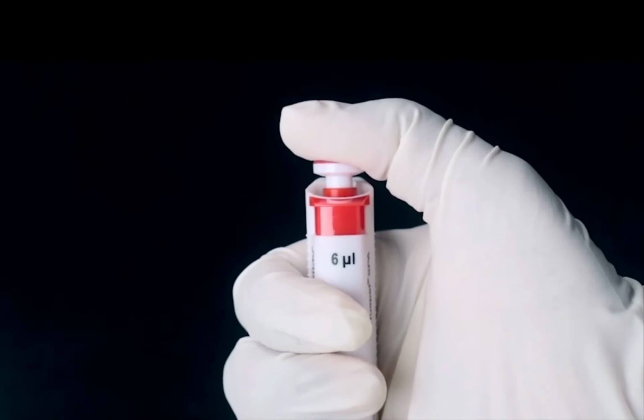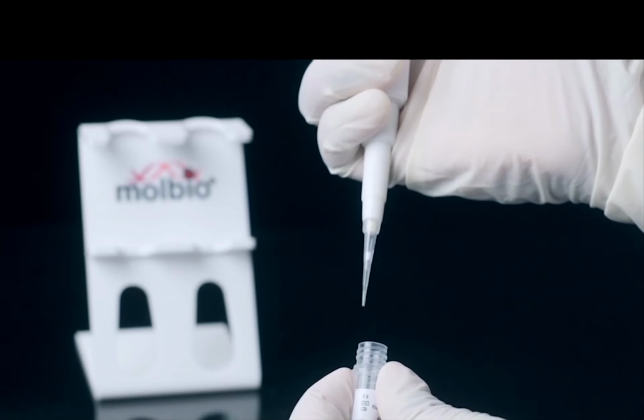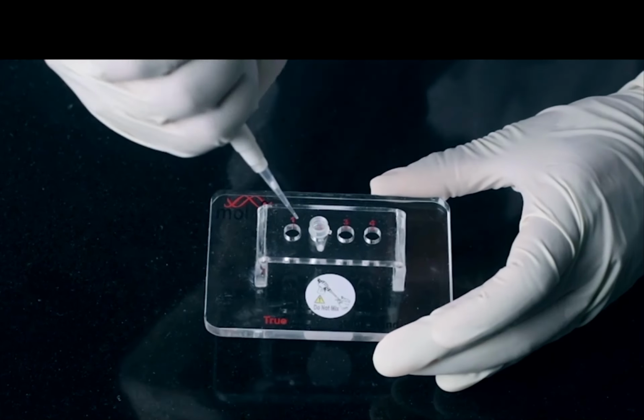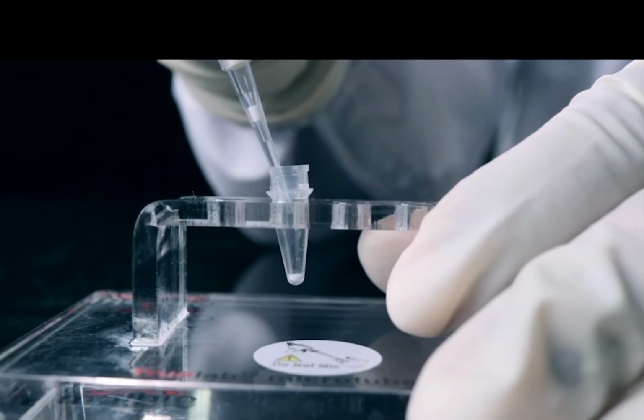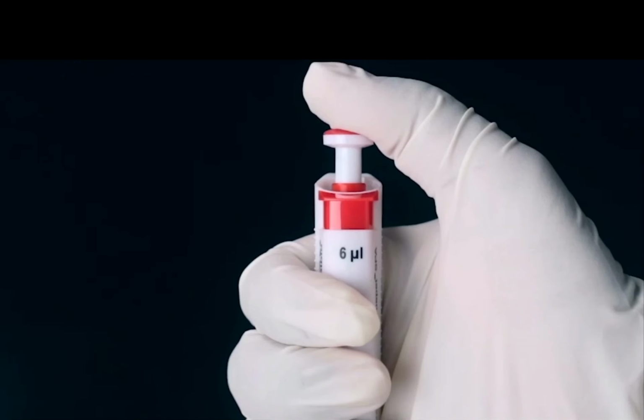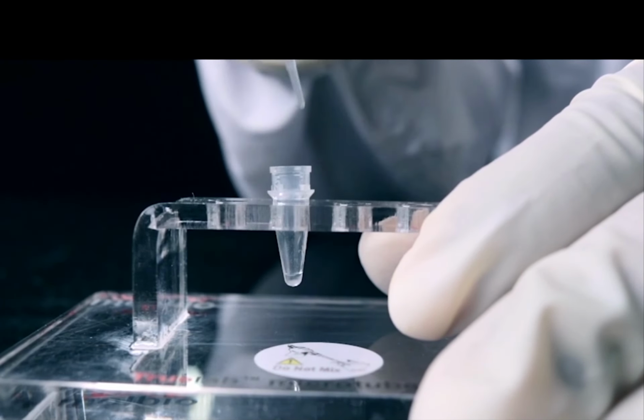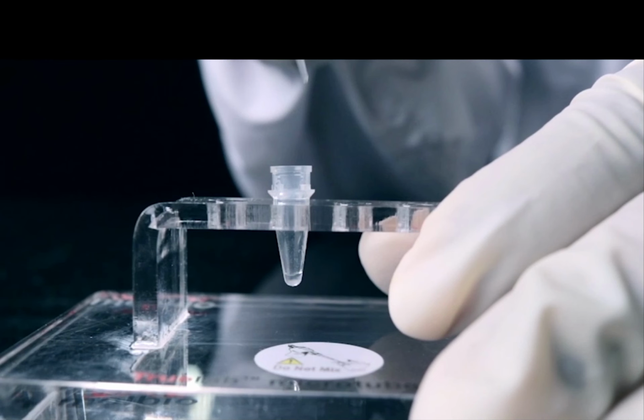So 6 microliter, slowly release. All pipetting, slowly release. Here you have to go near the thing and slowly release. Please don't touch the white color thing. Slowly release along the wall, and you don't have to mix. Don't keep pressing and mixing, no reverse pipetting. Don't do anything. Just release it on the side. It will mix itself.